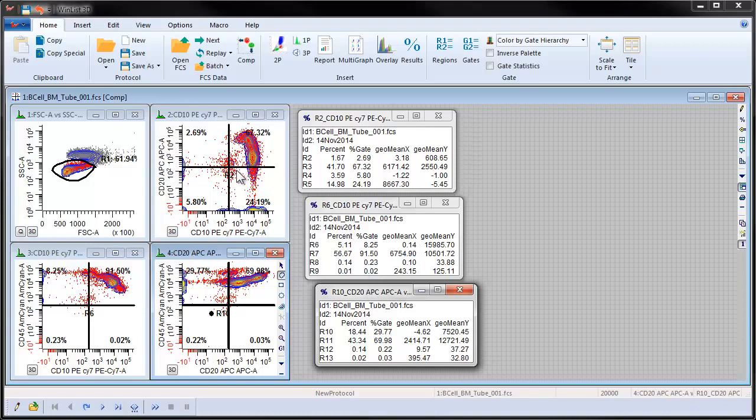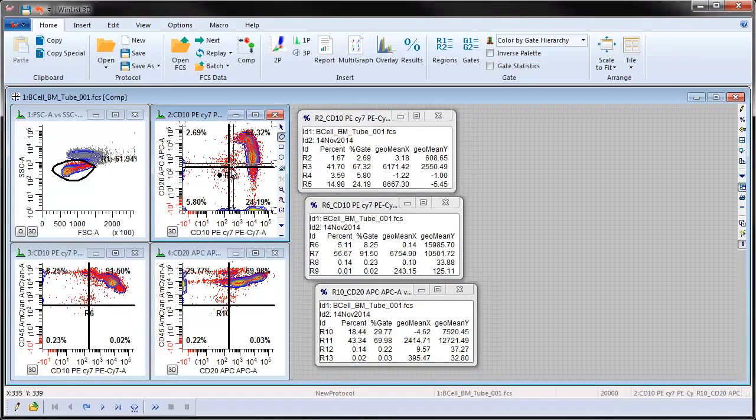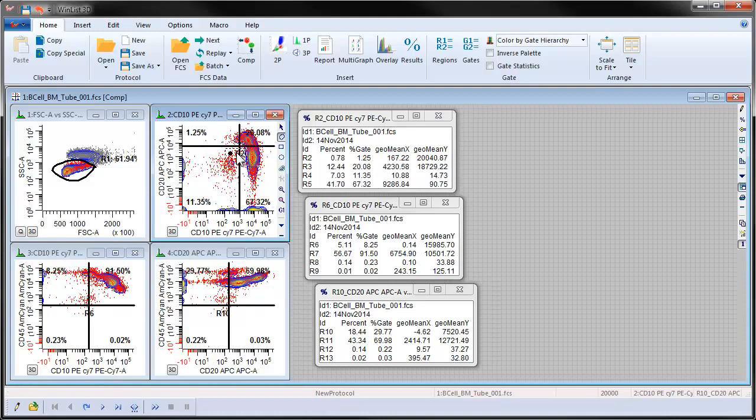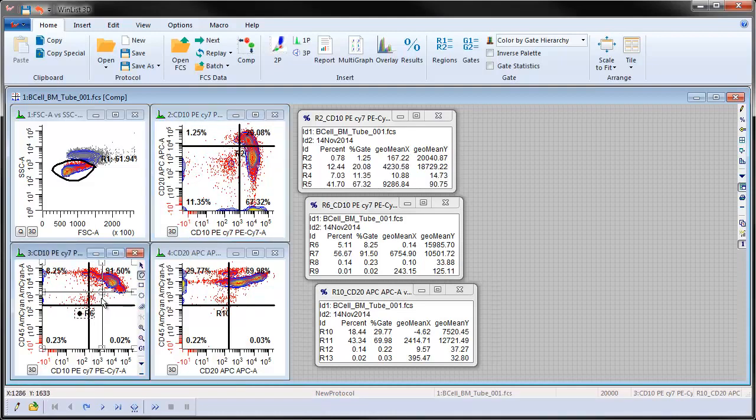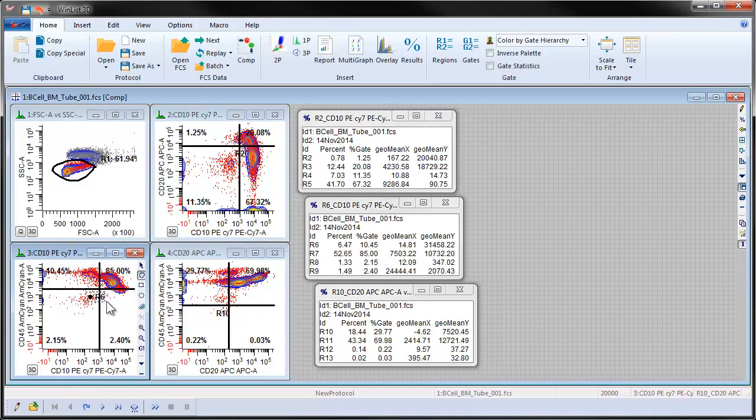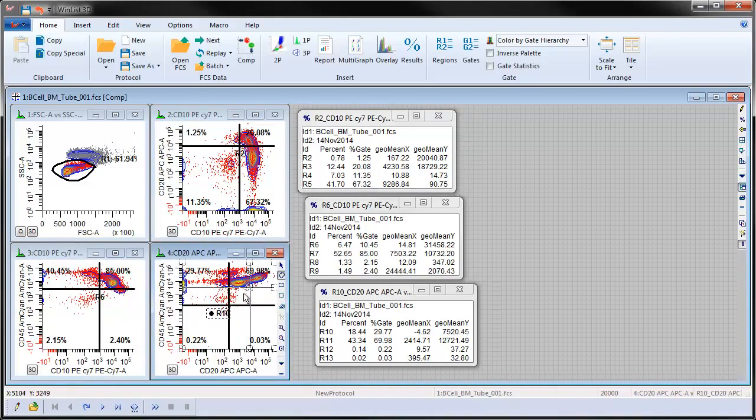To adjust the quadstat, click and hold on the region label in the center of the quadstat and drag the vertex to a new position and release the mouse. Statistics will be updated automatically as the regions are moved.